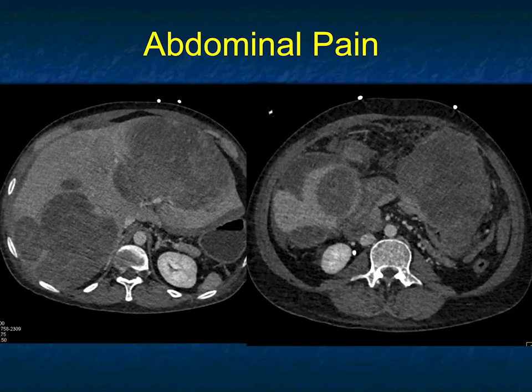This patient has abdominal pain, and what do you see? You see multiple liver metastases, and there's blood around the edge of the lesions in the right lobe of the liver. So now you ask: what can bleed in the liver? We think about hepatic adenomas, hepatomas, trauma, biopsy. But what else gives you cystic lesions that bleed?